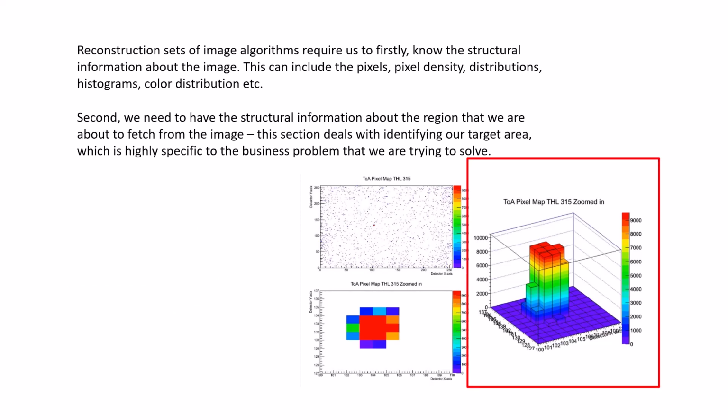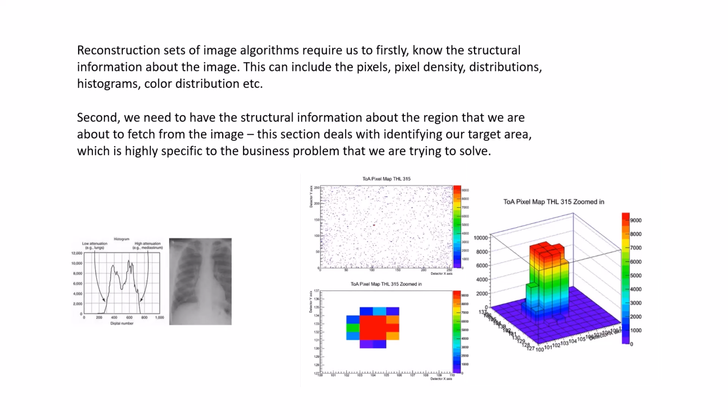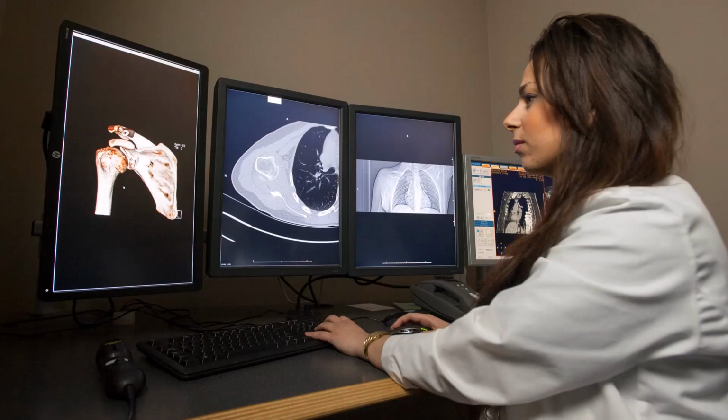With a histogram that is only a bar graph of height and width, we're only able to create a 2D image. Obviously, the images that are created today using computers are much more sophisticated than the simple images that we used in the olden days by using stereoscopic imaging technique with X-ray.